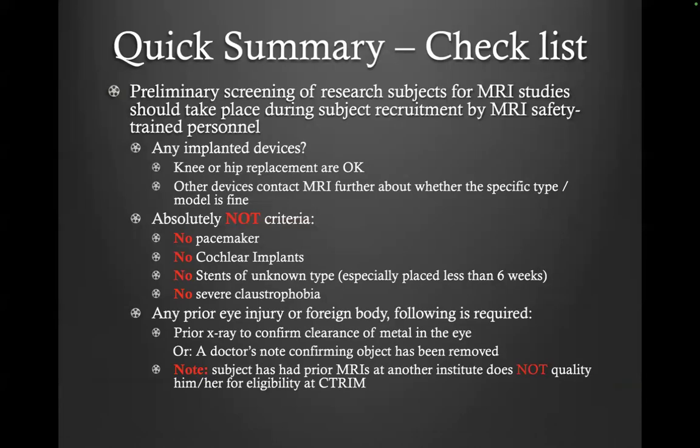Here is a very quick summary, a checklist, just as a very brief list. Again, it's not exhaustive, but preliminary screening of research subjects for MRI studies should take place during subject recruitment by MRI safety trained personnel, namely you guys. And the questions will include, do you have any implanted devices? Usually, knee or hip replacements are okay, and all these orthopedic devices, but you should still mark yes and check with us. And for other devices, you should contact us to further understand if they are okay.